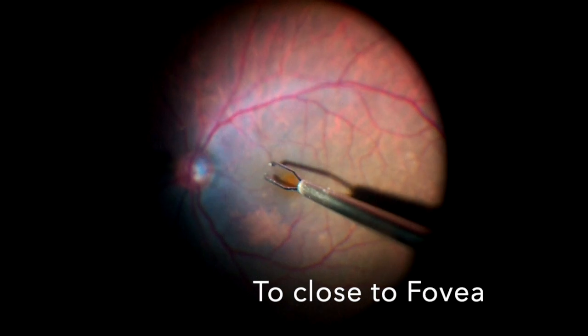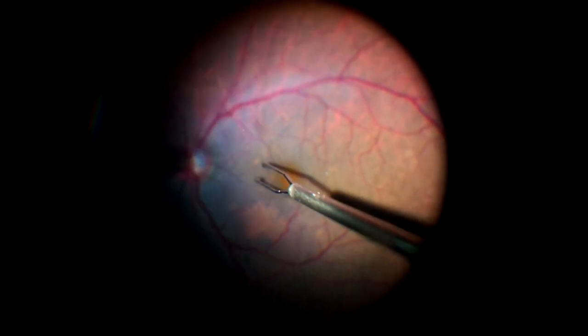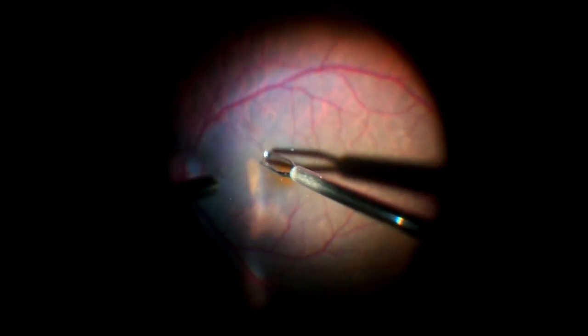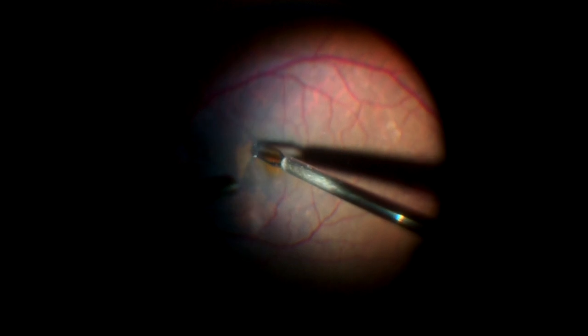In cases where you are holding the ILM very close to the fovea, there is always a risk of bleed occurring because major vessels or larger vessels will be there, and inadvertently if you touch there can be a bleed which can occur, like in this particular case.